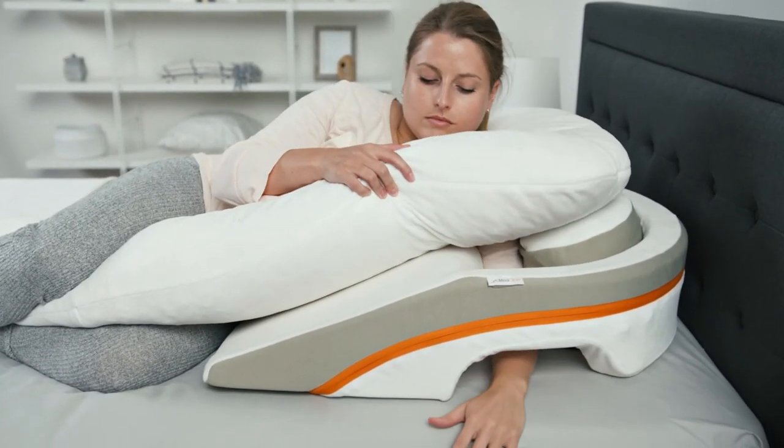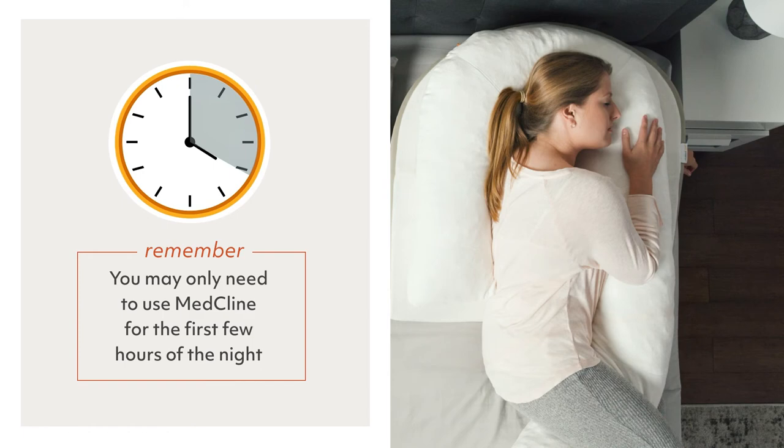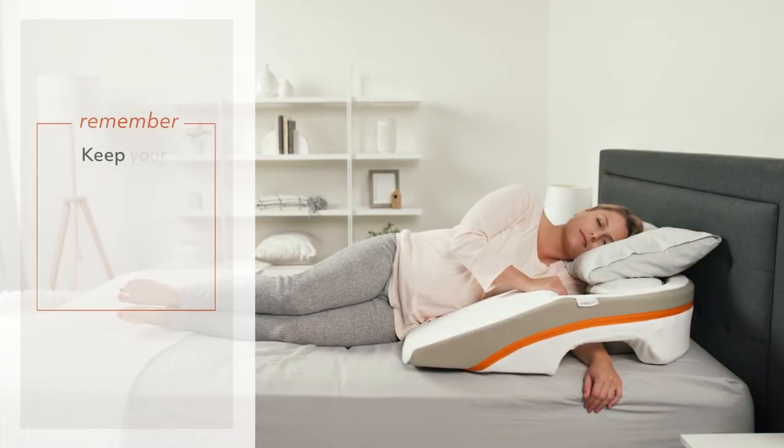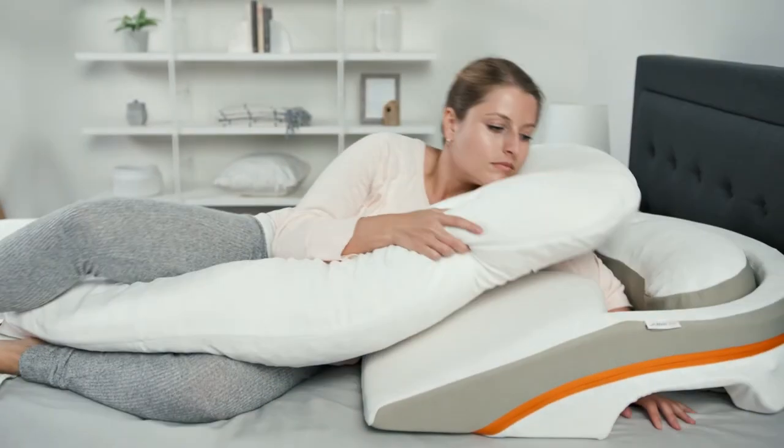Keep in mind that the length of time you need to use MedCline each night may vary. Most reflux episodes occur in the first half of the night, so you may only need to use MedCline for the first few hours. As a last note on positioning, keep your knees bent up toward your chest during use to avoid discomfort in the lower back.